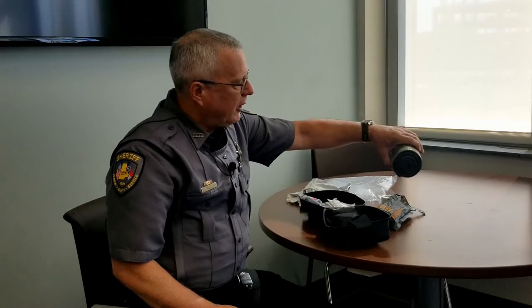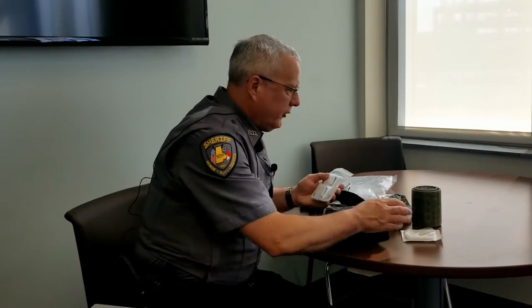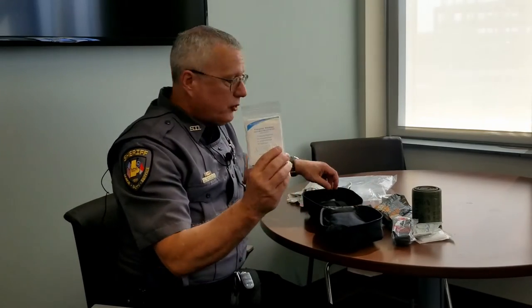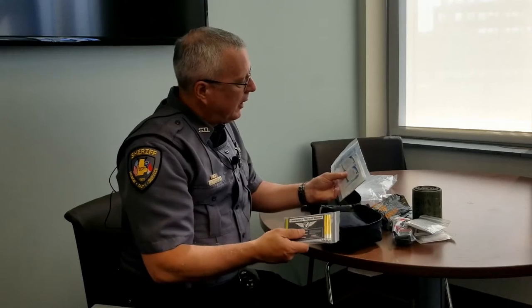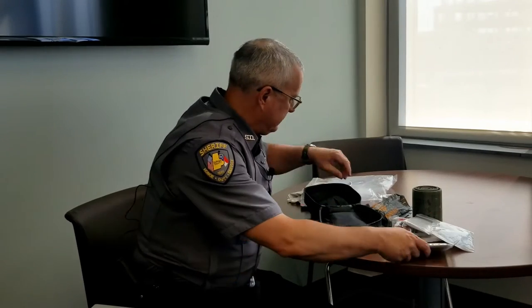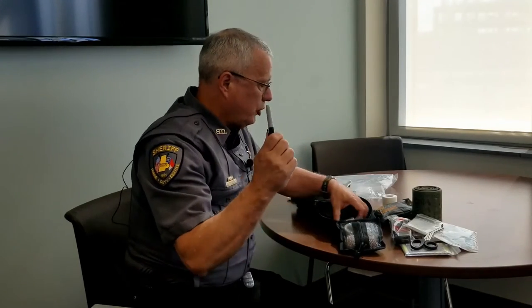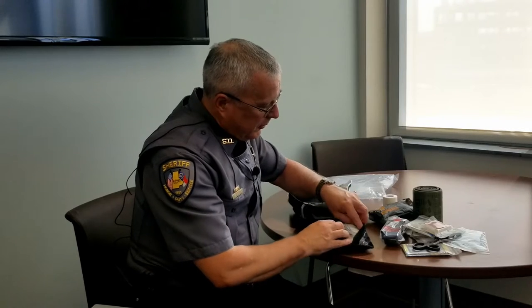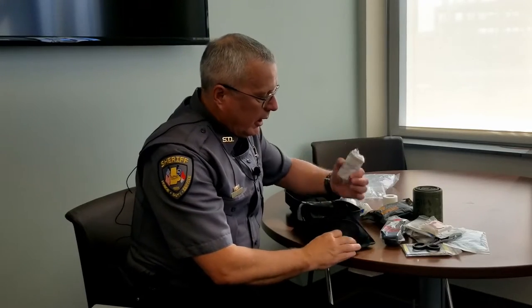This is what's called a SAM splint, very useful for fractures of ankles or wrists. These are just some gauze sponges, some alcohol wipes. There is a tourniquet in here and we'll go over that in detail in just a minute. A triangular bandage, an emergency blanket, antiseptic wipes and band-aids, bandage shears, a Sharpie, some compressed gauze, and then inside the zipper compartment, some gloves, some tape, and an ACE bandage.